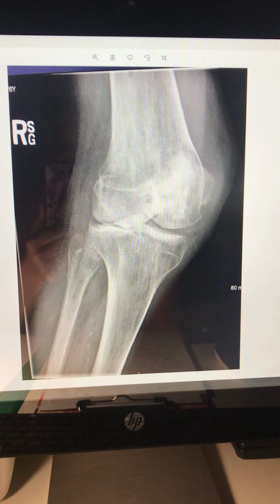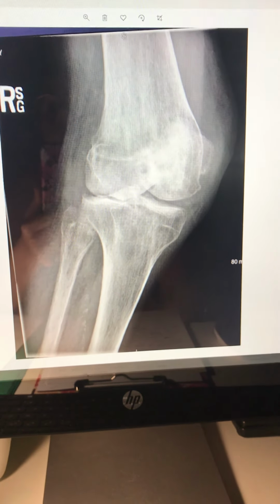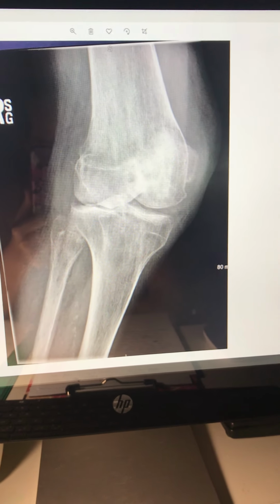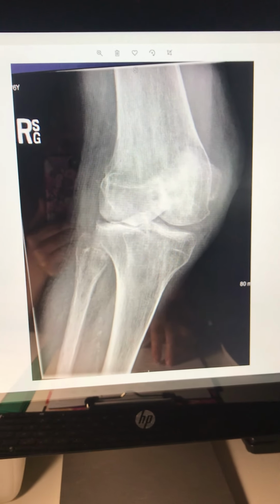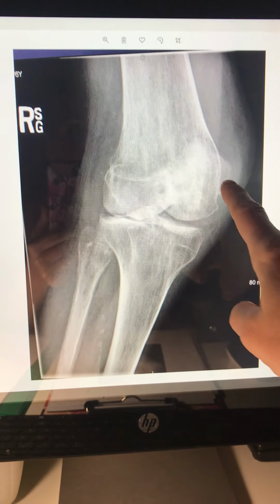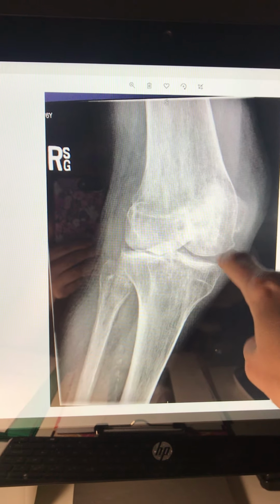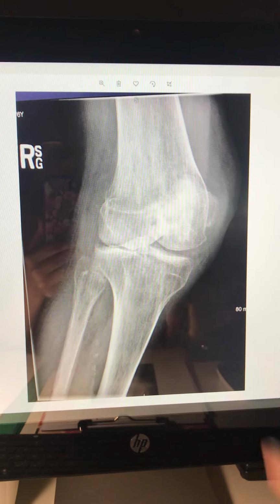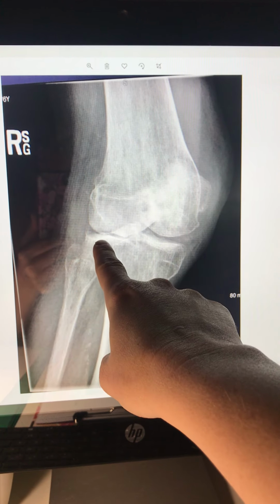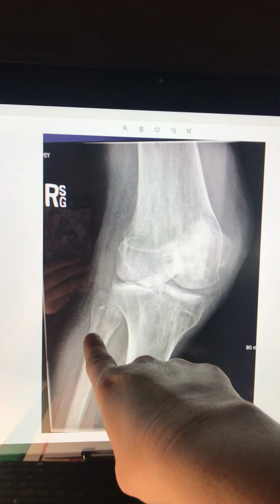I believe her leg should have been more medially rotated to open the tibiofibular joint right here. This should be open. It's not. It did still pass as diagnostic quality. The anatomy seen: have the patella right here, the medial femoral condyle is here, the medial plateau is right here, the lateral tibial condyle, and the fibula and tibia.